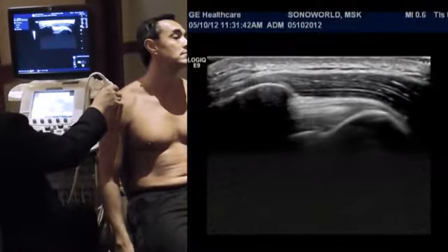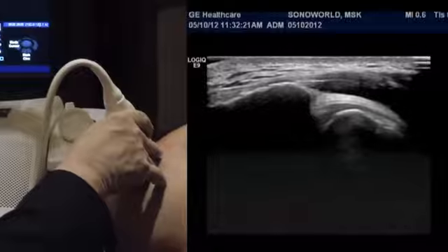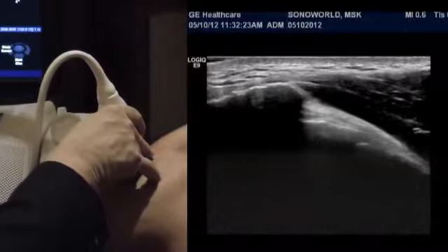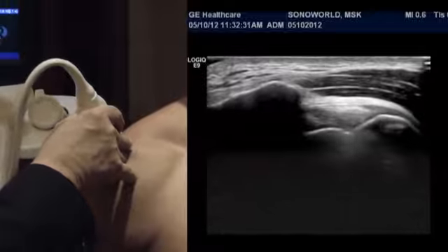In this maneuver, therefore, what is going to appear abnormal is if the entire 3 units cannot, with no friction at all, go underneath the subacromial space. Note the bone acoustic landmark of the acromion, which has no lateral type of subacromial spur. When you look at this type of maneuver, you'll appreciate that there is normal motion.